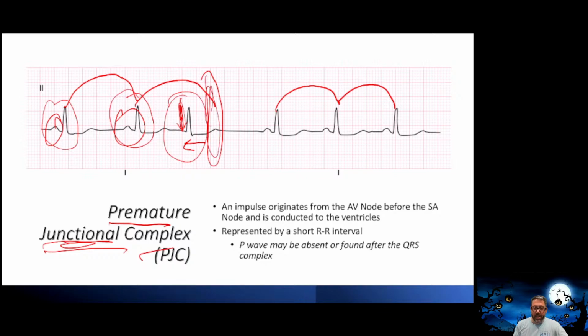This is where the beat should have landed with normal cardiac cycles. But we had a premature beat. It ended earlier. Now we have what's called a compensatory pause. This is not a bad thing. This is called a compensatory pause. We're waiting for the cycle to start up again. So that's what you know, it's a compensatory pause, not a sinus pause, because you can march it out and it would make sense as far as where it should have dropped. So that is what that one's talking about.